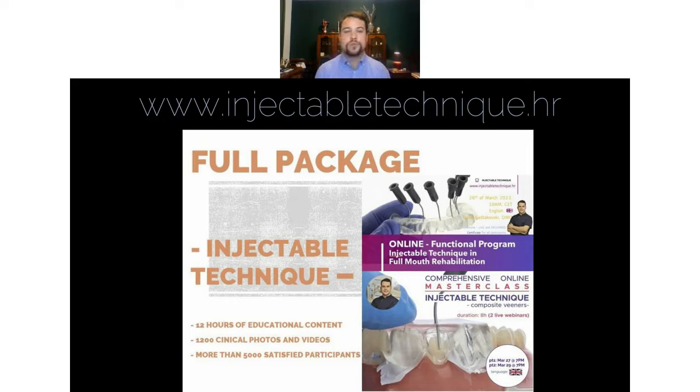What polishing material do you use? If you're asking about the polishing spirals, the one from 3M is good, the one from Ivoclar is good, the one from EVE Twist is also good, but the EVE is a little bit more aggressive, in my opinion. I like the flexible one. For the paste, I use the Polisher paste from GC in combination with a cotton buffer from Renfert.